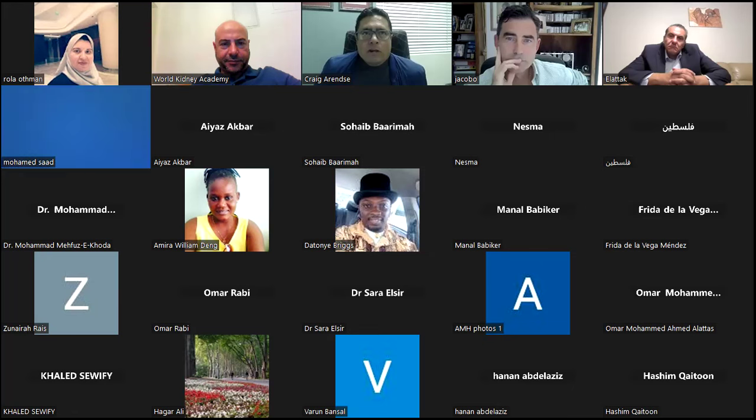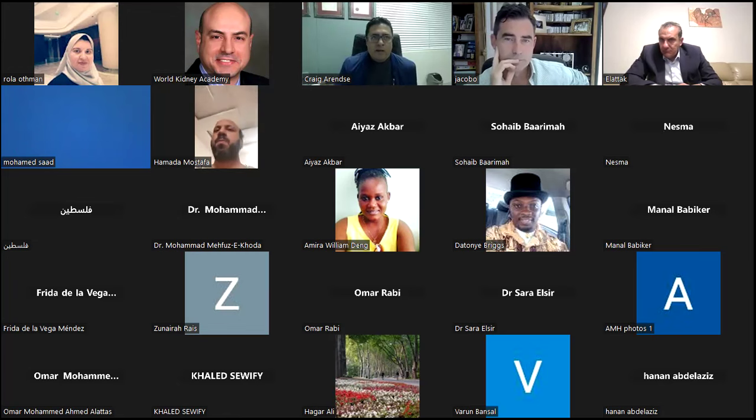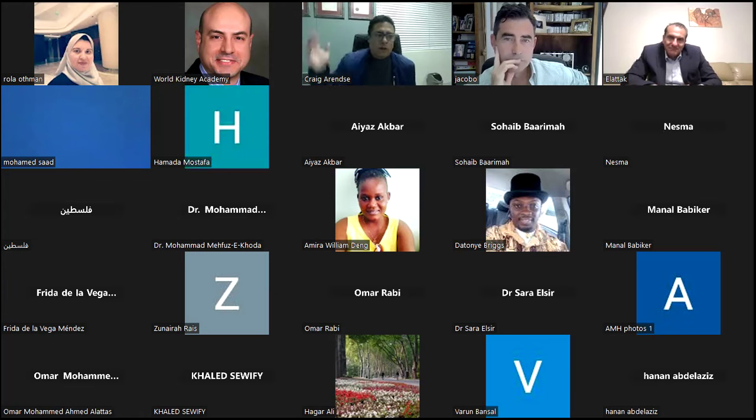Yeah, I would like to just make 2 points. So first of all, with all these pressure pumps and all this monitoring and all this technology that we have right at our fingertips, I think the principle is important that we not get too focused on absolute numbers, but rather on trends. So you need to really have a dialysis team, a nursing staff and technical staff that is trained to not just call you when the number has reached a certain maximum value, and rather be more cognizant of what the trend is over time.